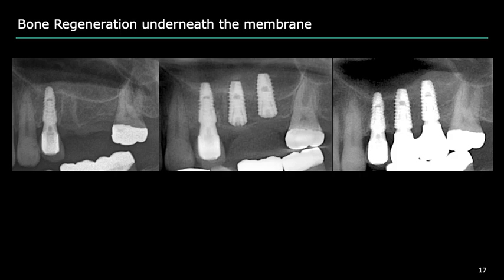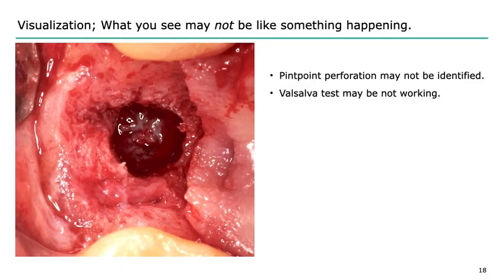So two dental implants were placed without graft material, and new sinus floor was confirmed after final restoration here. This is a demarcation of the sinus floor, and the sinus floor just goes up like this. With all these innovative instruments, a perforation is still happening.